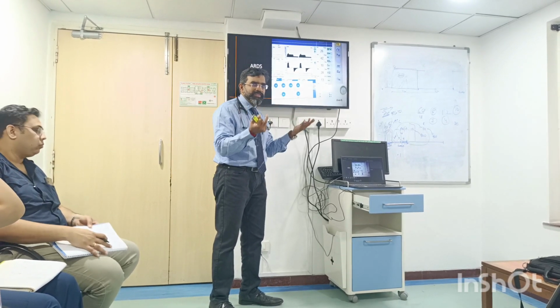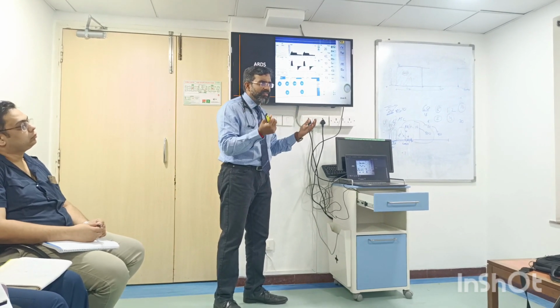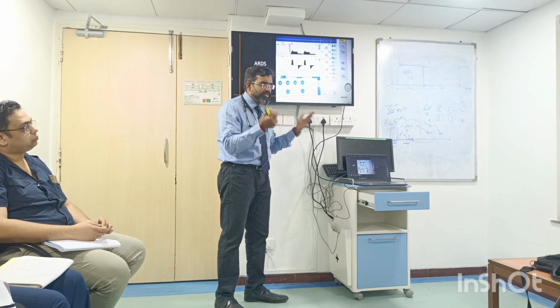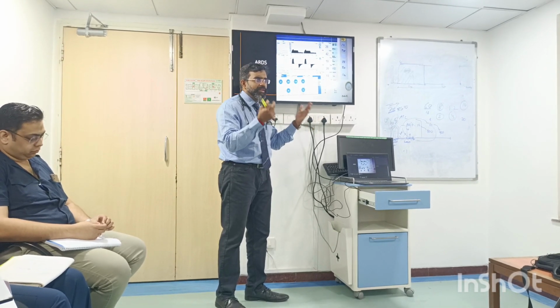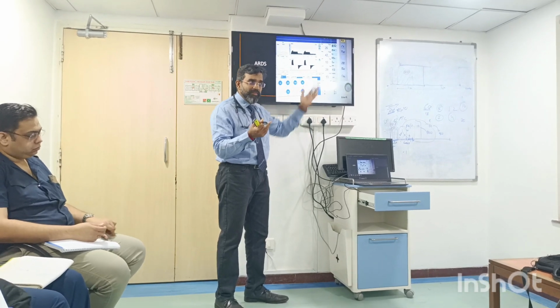My characteristics are not changing. You understand? I want him to be in such a way that he's breathing comfortably, synchronizing with the ventilator, such that my mean airway pressures are doing what they're supposed to do. My airway pressure is doing what it's supposed to do, right? So these are the things I will look at here.